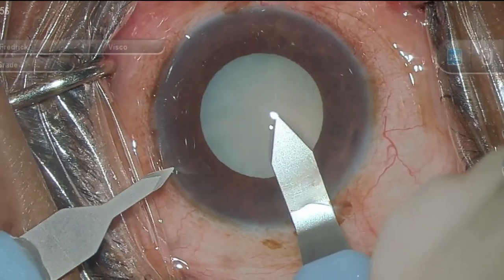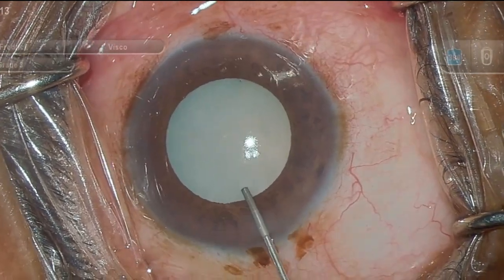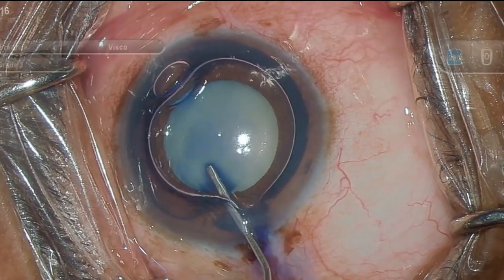After making the incision and side port, staining of the anterior lens capsule is done with trypan blue. Make sure that the capsule is fully and properly stained.